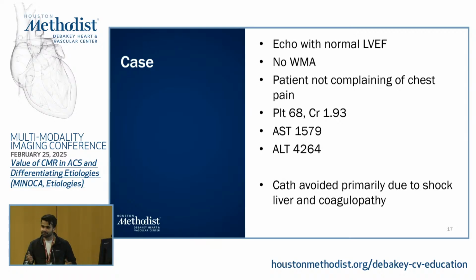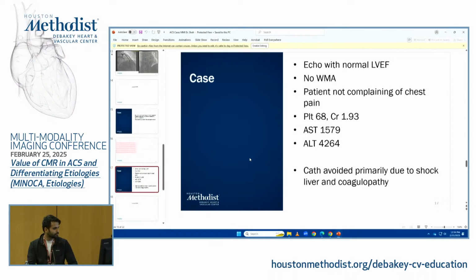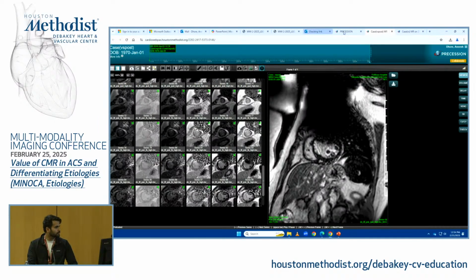So that's one thing, at least from my quick review of that. So then the patient eventually gets a CMR when they're stable. So this was day 3. That's why we have so many troponins. And I'll quickly jump to that.